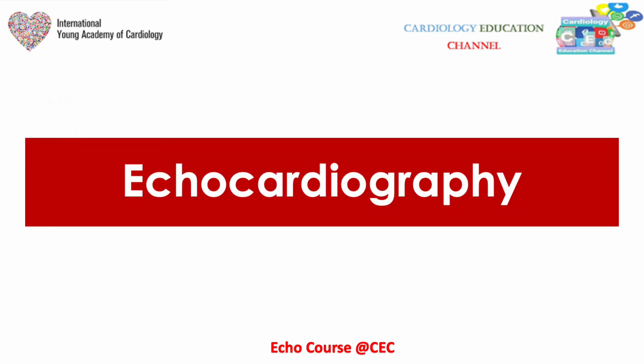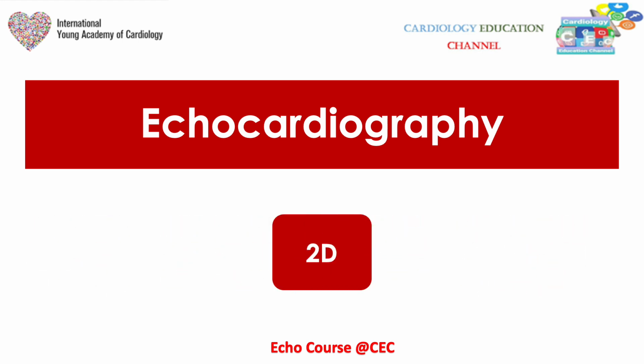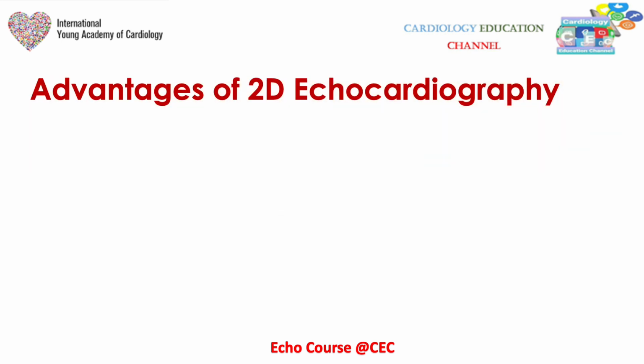Now we are moving to basic echocardiography for assessing the LV systolic function. We have 2D, contrast echocardiography, 3D, and strain assessment. We will start by talking about the 2D assessment of the LV function.